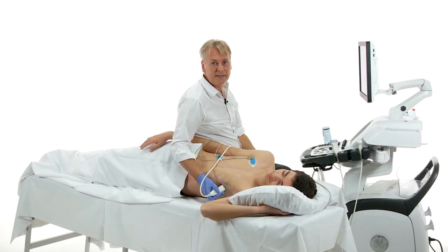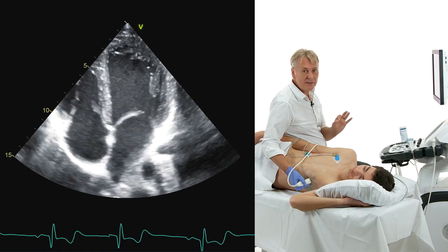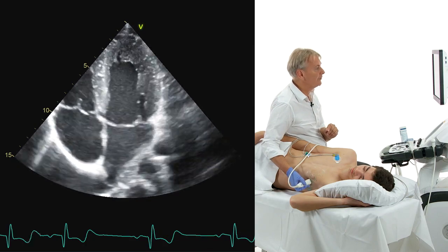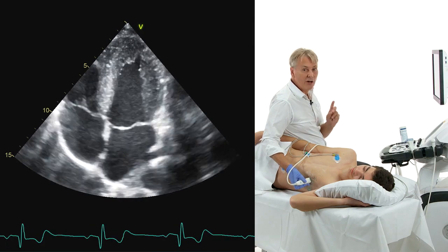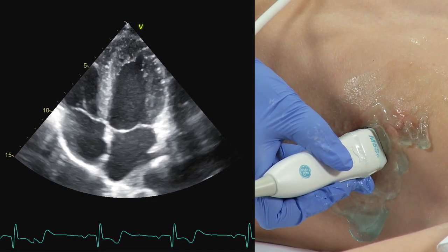Many people, especially at the beginning, have problems to display the two-chamber view. Now, traditionally, the way you would find it is that you start with the four-chamber view and then rotate counterclockwise. If you do this, it's very important, however, to have the maximal length, so no foreshortened ventricle in your field of view, and to place the ventricle really in the middle of the screen. When you rotate, fix the transducer so that it doesn't slide away from the position, and also don't change the tilt.